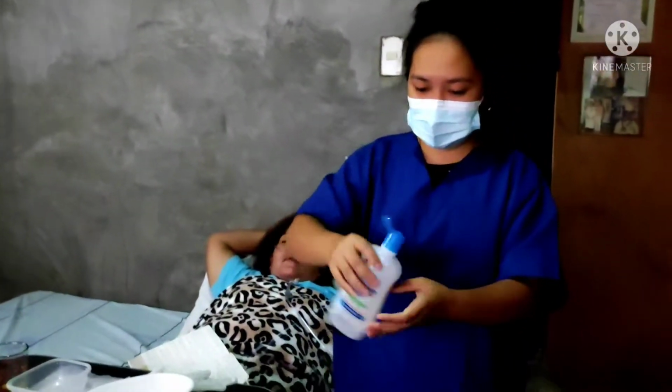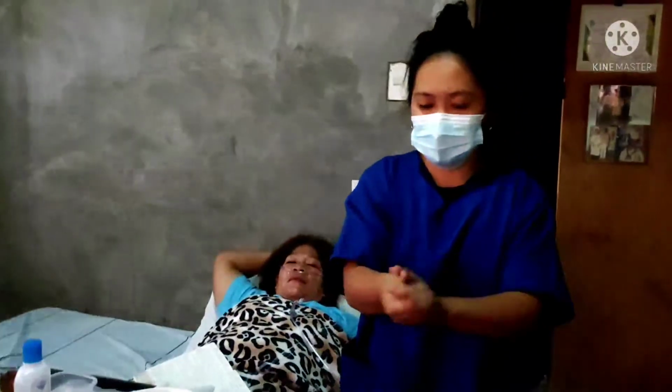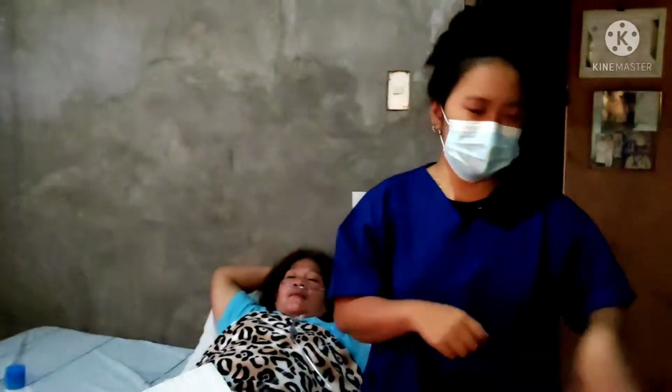The procedure: perform hand hygiene to prevent spread of infection. Ensure privacy to maintain privacy.